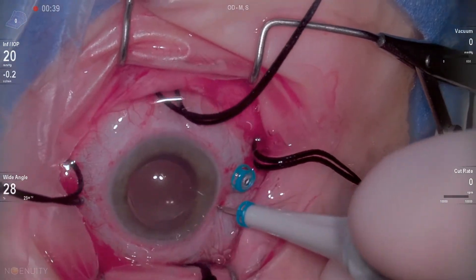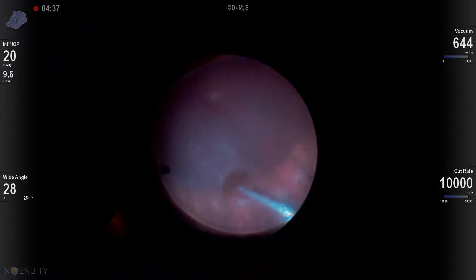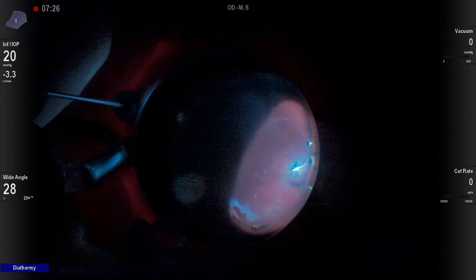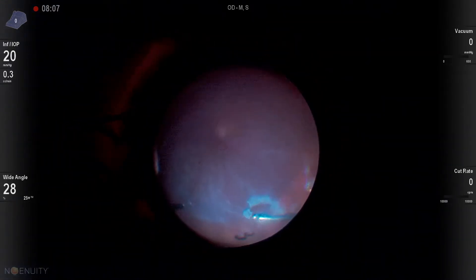This is an interesting case. What really happens after this case is probably more interesting. This is a patient that came in with a chronic retinal detachment. She knew before her cataract surgery that her retina was detached. We went ahead and had the cataract surgeon take the cataract out because it looked like almost an open funnel type of detachment on ultrasound.